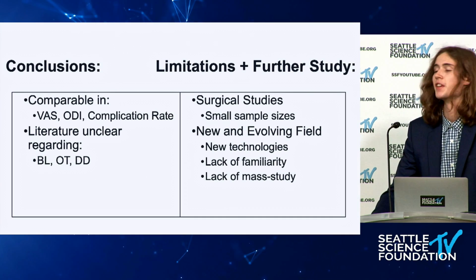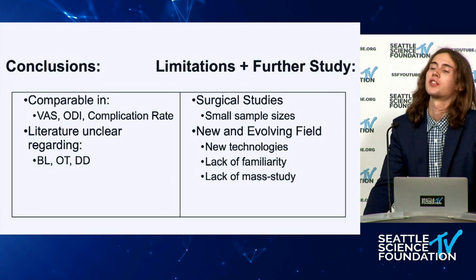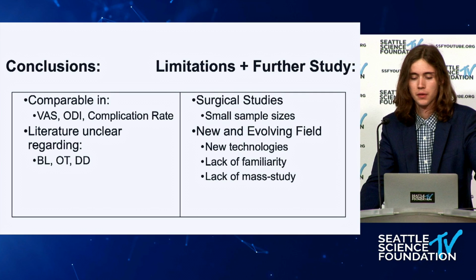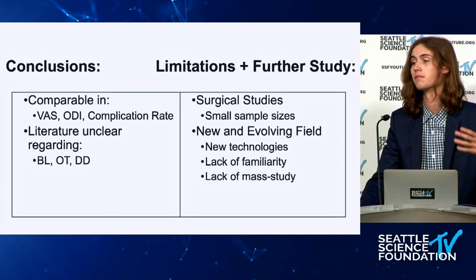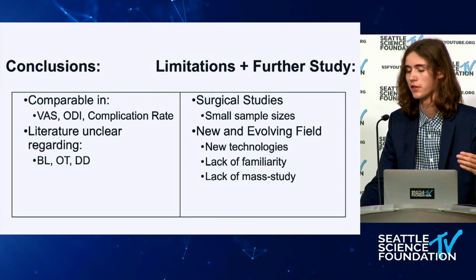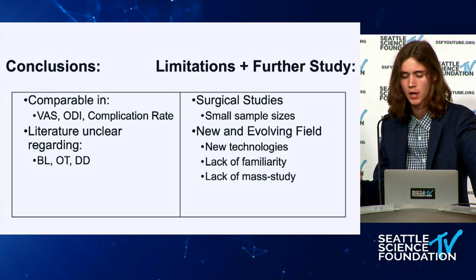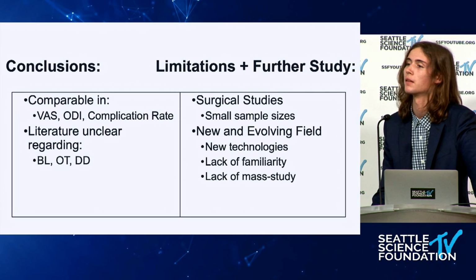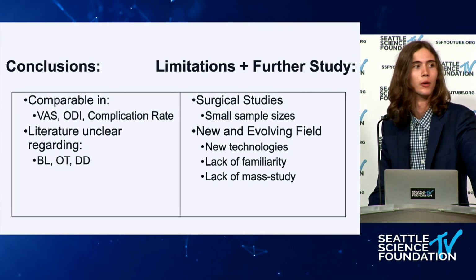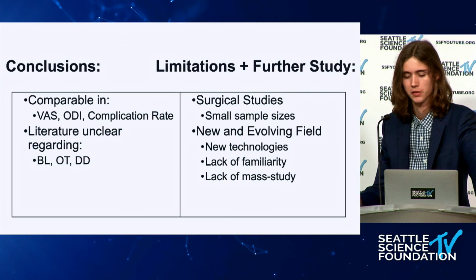Additionally, this technology has a lot of potential, and we know that because the potential yield of precision is something we haven't seen before. That's something that humans can't do. It allows us to have reduced X-ray exposure for surgeons. So theoretically, we're not just seeing better outcomes down the line for surgeons in terms of less radiation exposure, but potentially for patients as well.